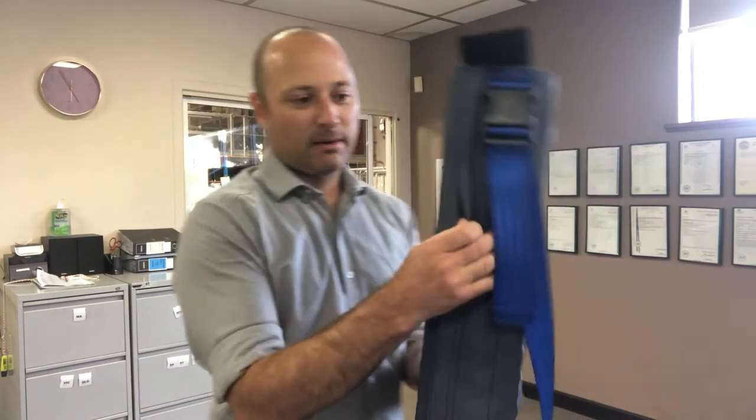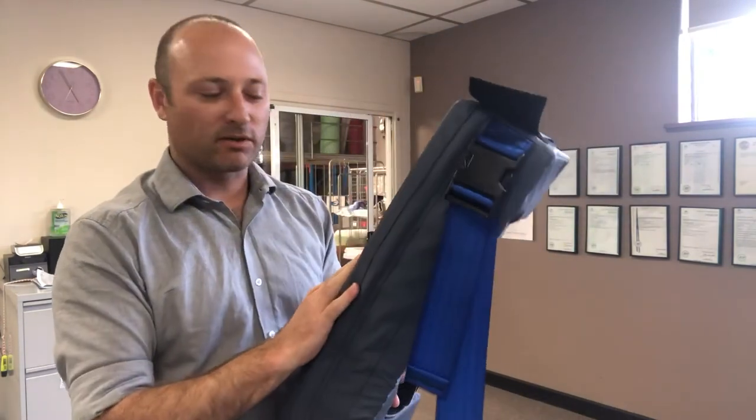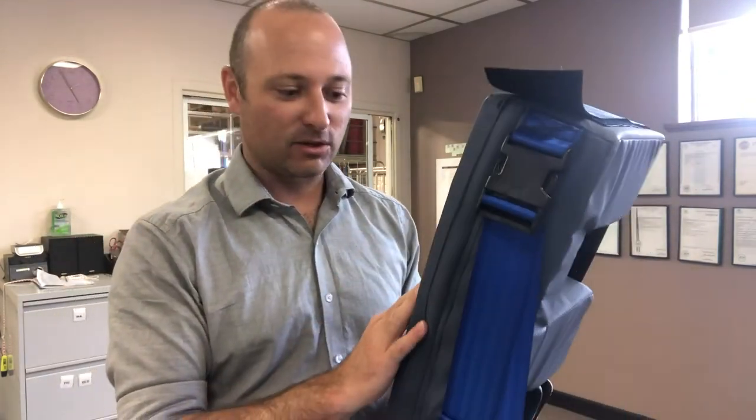There's a zip at the back so you can take the cover off for washing. It is a wipeable material, but there is stitching so it's not a 100% heat-sealed unit.